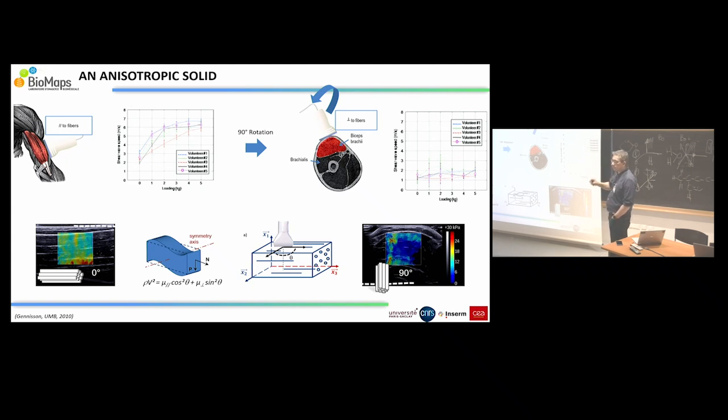So like this, we are able to quantify an anisotropic ratio in the tissue. And it is currently used by my colleagues in Nantes to characterize some myopathies, because when you have some myopathies, the fibers are replaced by fat infiltration or fibrosis or other things like that. And this ratio changes a lot. So it's a new information that helps them to characterize different pathologies.